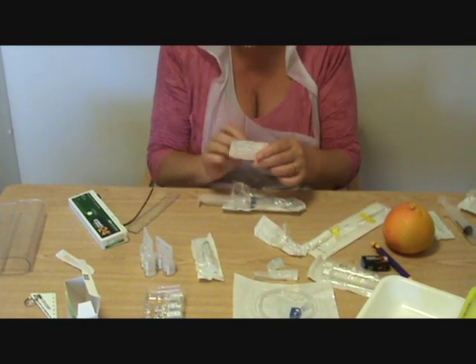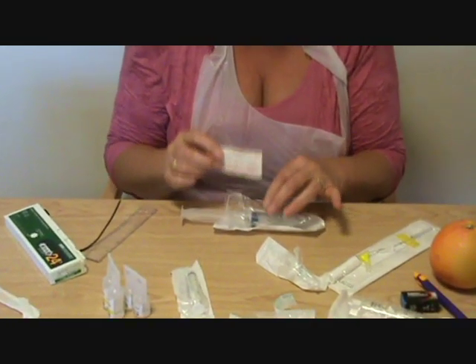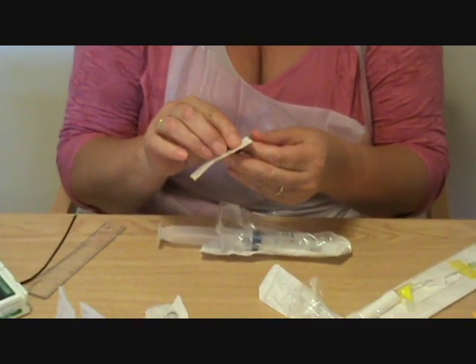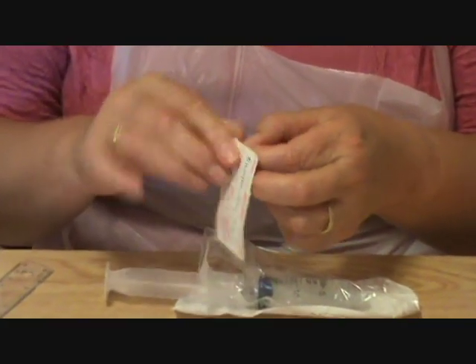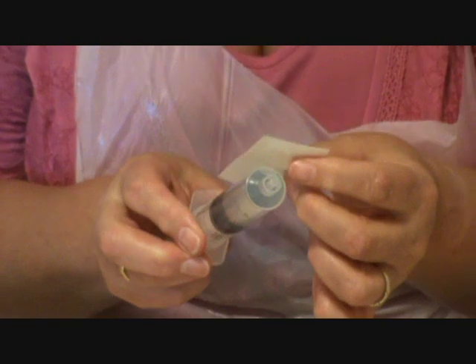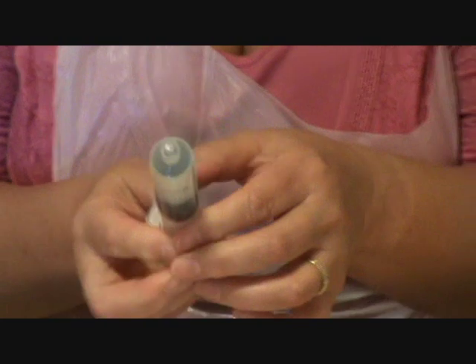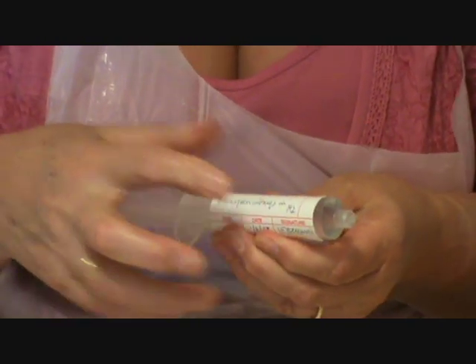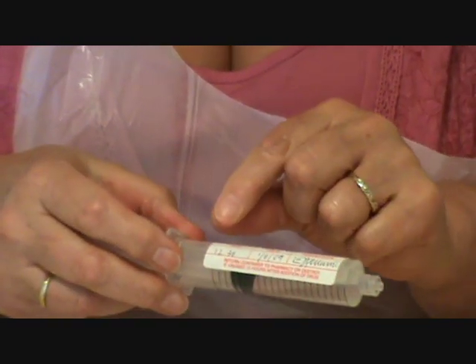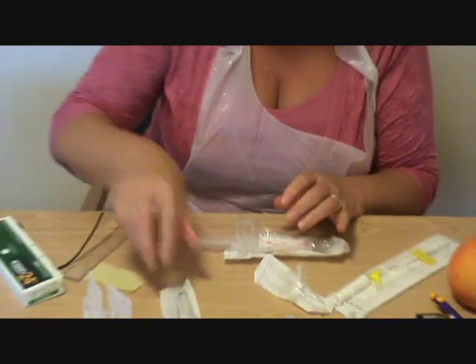Before I measure that, I'm going to add the label so that if I'm called away, somebody knows exactly what is in this syringe. Make sure you don't put it on where you can't see the markings on the syringe. I've put on here the drug, how much, and what I've diluted it in. I've put the time, I've put the date, and I've signed it.